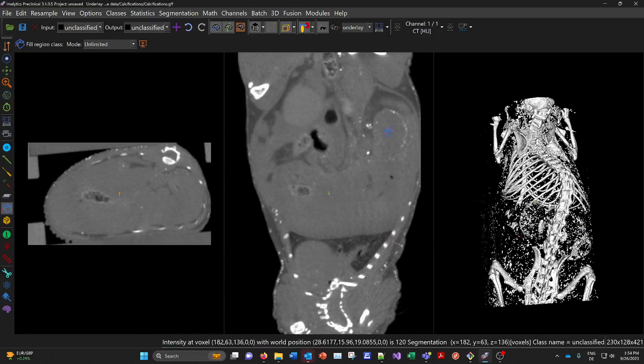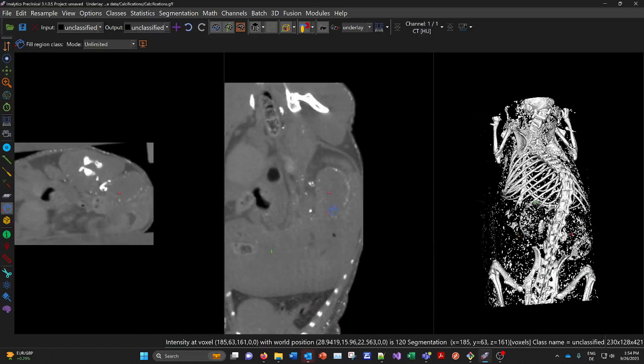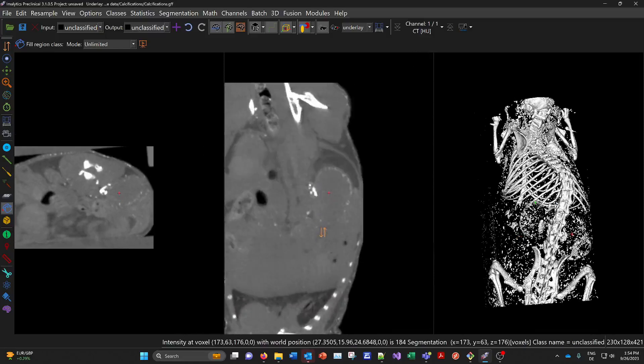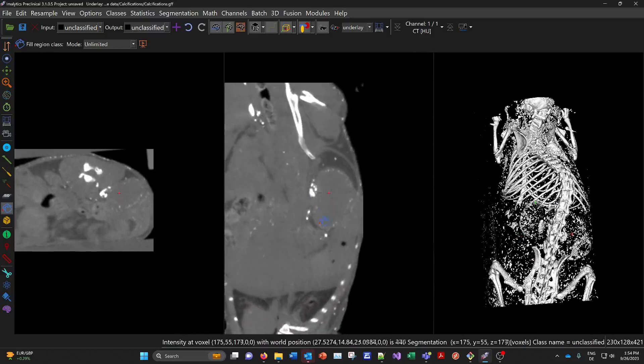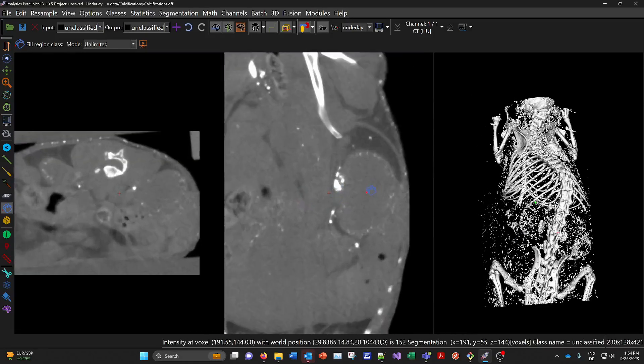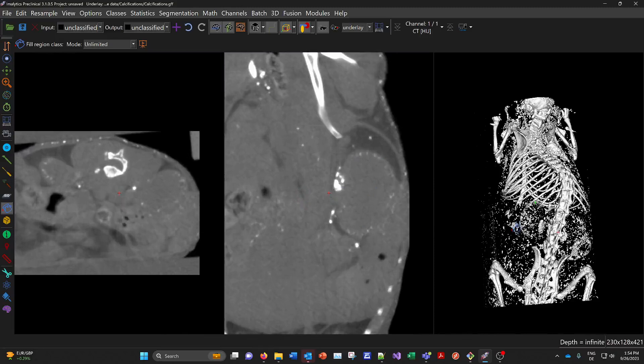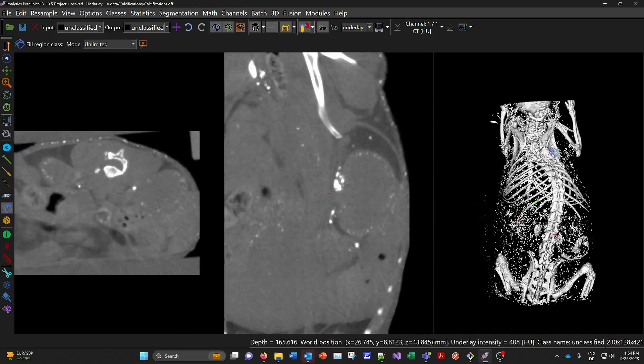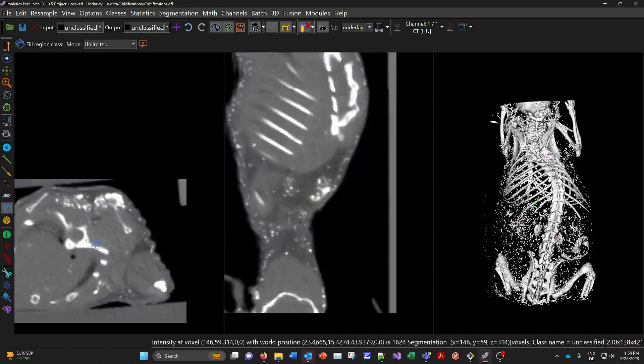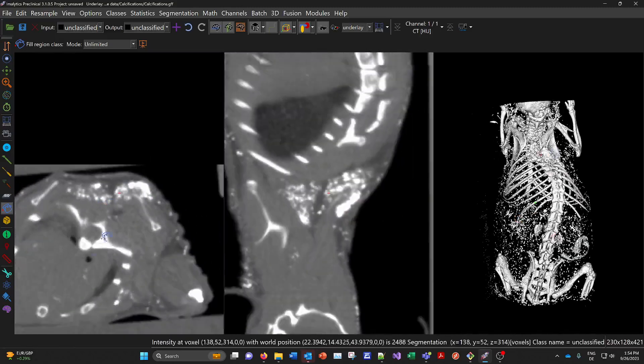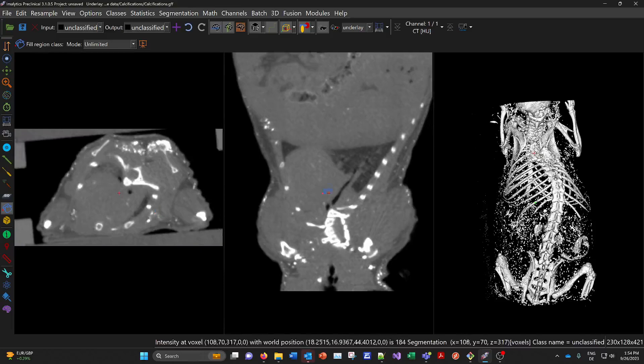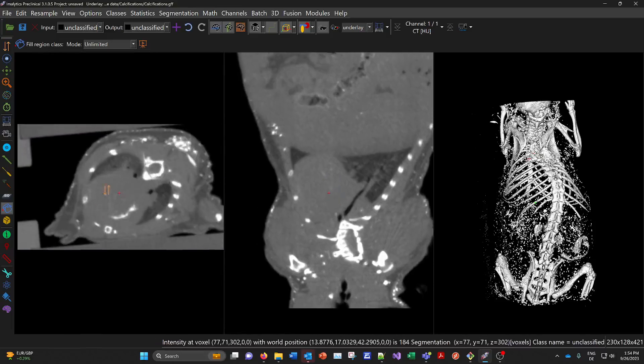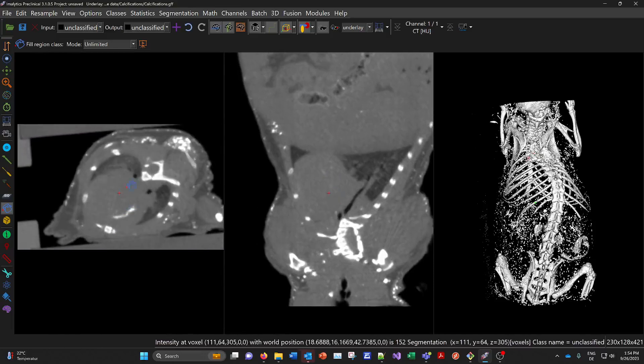But first I'll show you a bit of the CT data here so that there are a lot of calcifications in this mouse model. For example here in the kidneys you can see it in 3D also. But also in the brown fat here in the neck. And all over the body in the heart also here.